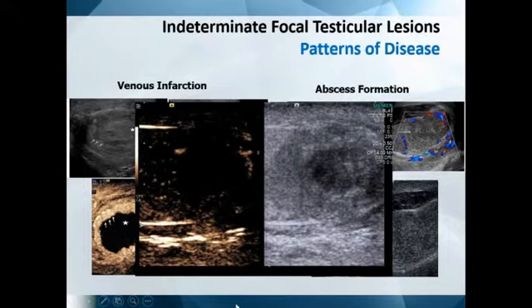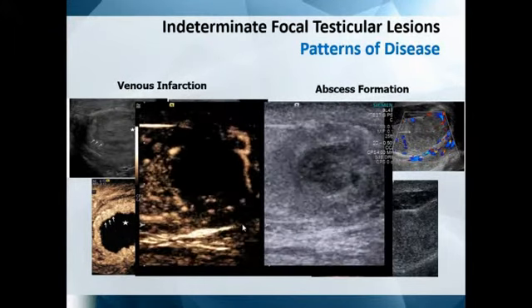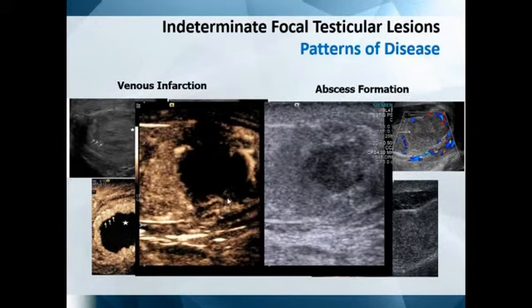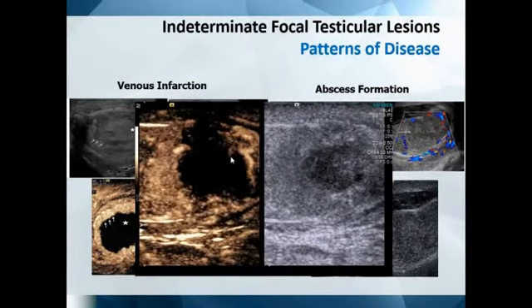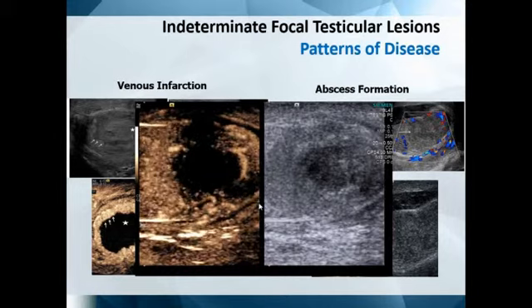And this is the dynamic view of this area here, and you can see as it's coming in, you've got hyper-enhancement around the wall, you've got irregularity of the wall, those septations are forming, it's raggedy, irregular, this is an abscess.